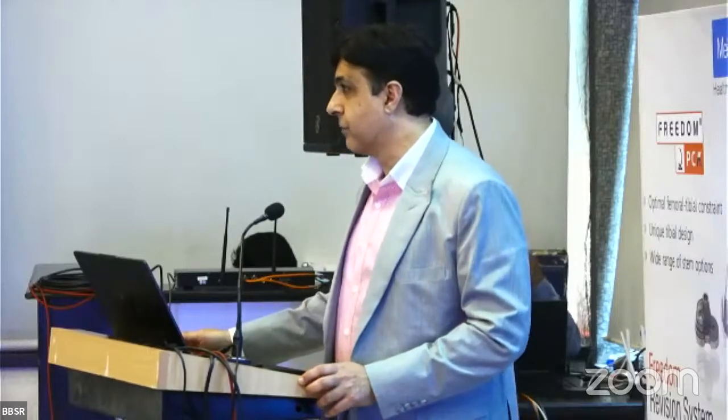So from all these cases, what I want to bring across to you is the fact that you see a different kind of presentation when you see revisions. You see different kinds of failures. Your mind has to always work on what went wrong. Equally, what kind of armamentarium or inventory we need to have as a fallback plan. So you have to be ready: if the option is A, this is my plan. If the option is B, this is going to be my plan, because the decision is not pre-decided in this case. If the extensor apparatus is gone, the decision would have been different.